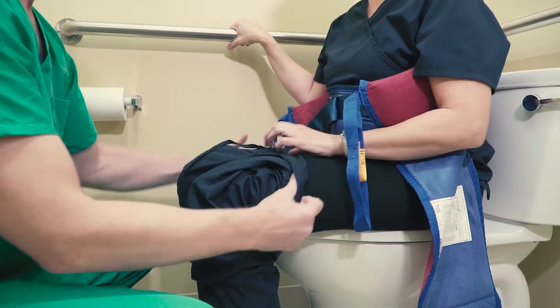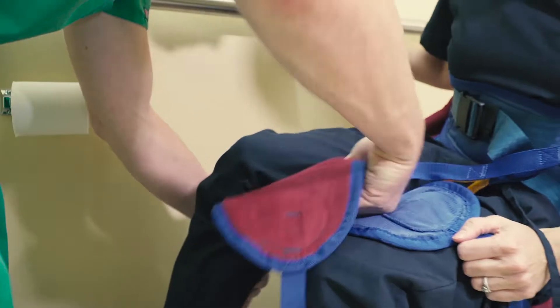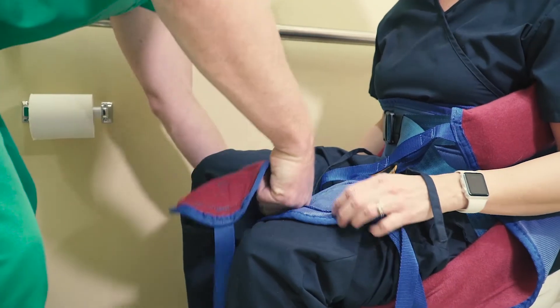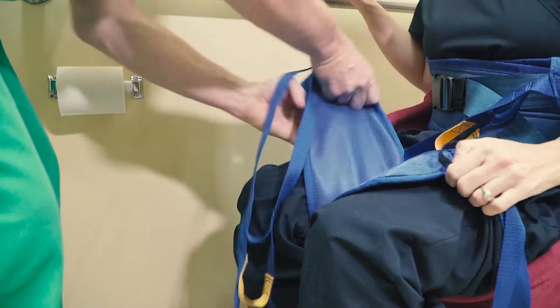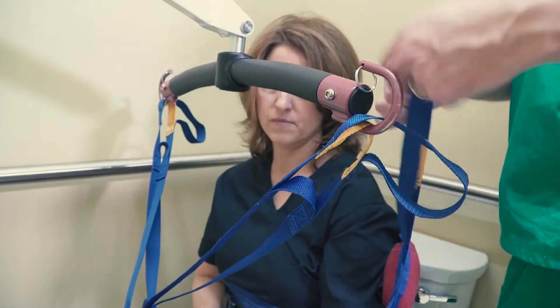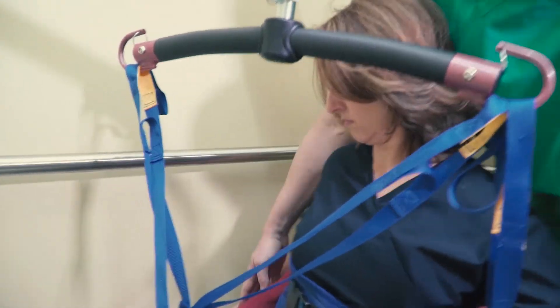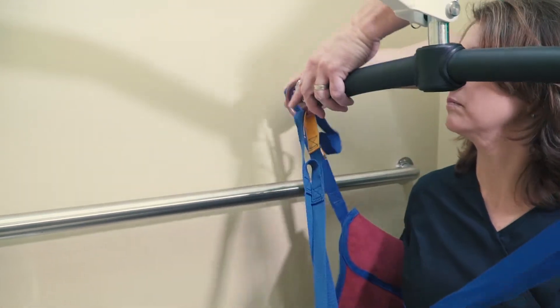When you return, help the patient pull their pants up and gently lift each of the patient's legs to pull the straps underneath and over the patient's legs. Cross the straps and remember that you want them positioned at mid-thigh for the most comfortable transfer. Bring the lift back in but do not lock it in position, and attach the sling loops to the lift bar.